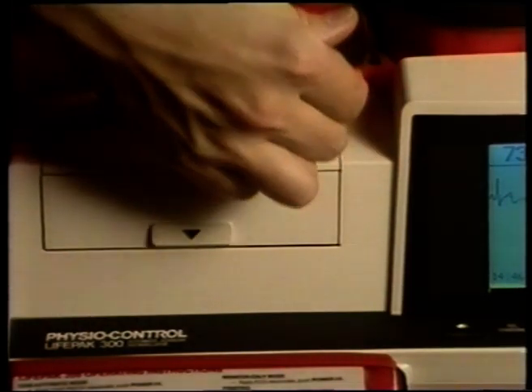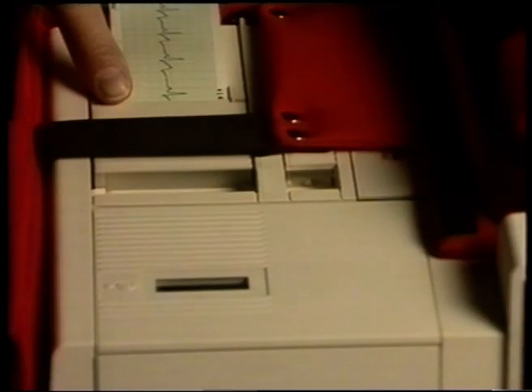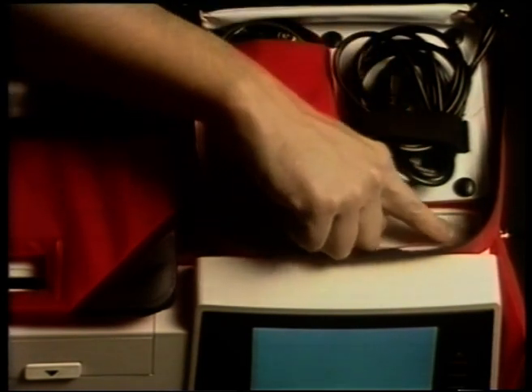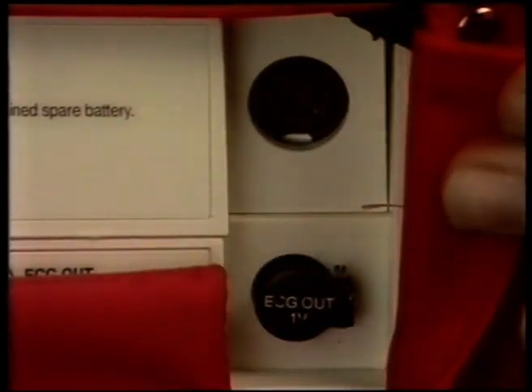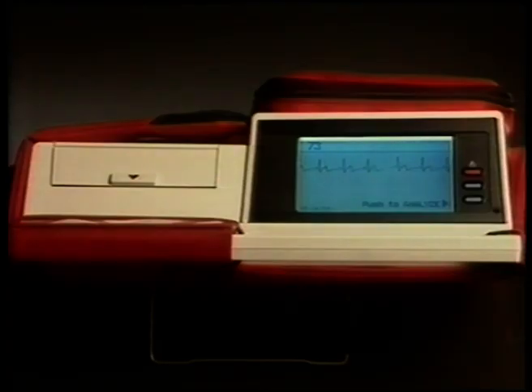A tape deck that records your voices and the patient's ECG signal is located to the left of the display. To access the tape, push the arrow indicator located on the front. The printer is located at the back left. Beside it is the battery release latch and the removable sealed lead-acid battery. Behind the display is the patient cable connector. Located on the back is the battery charger port and the ECG out port for transmission of ECG. And finally, the bottom of the LIFEPAK 300 features an inclined bail that can improve the viewing angle if the unit is placed below eye level.